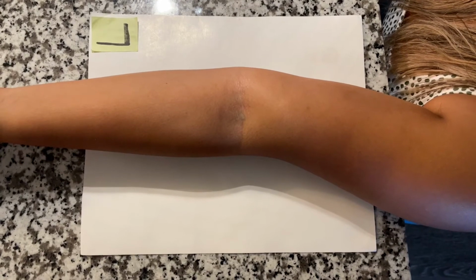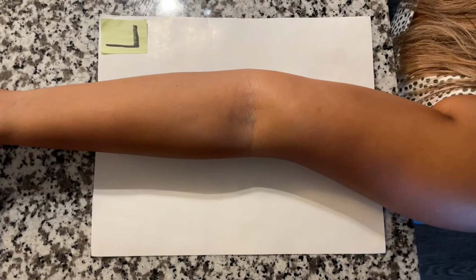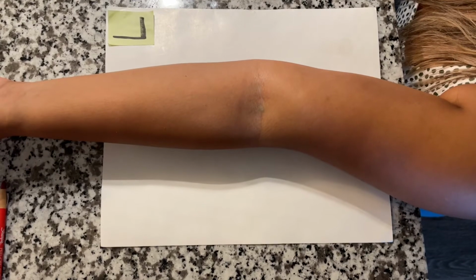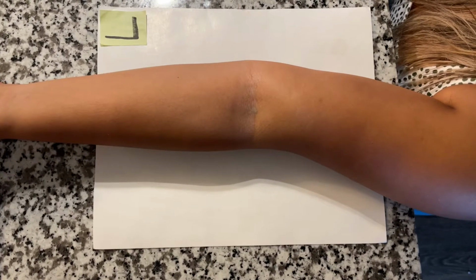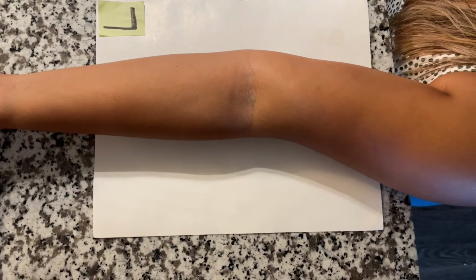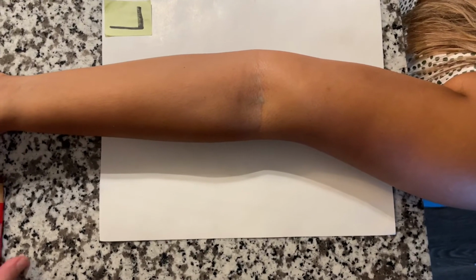For the following elbow films, we're going to be using two 10 by 12 cassettes with two views per cassette. We'll have a left marker, and the SID is 40 inches. For an AP elbow, we'll have the hand supinated and the elbow extended. The hand must be supinated to prevent rotation of the radius and ulna. The elbow joint is centered to the film, and a line through the humeral epicondyles is parallel to the plane. The center ray is directly perpendicular to the elbow joint.